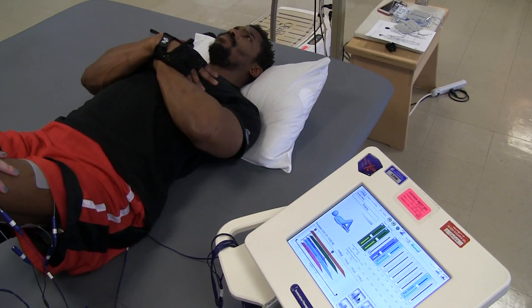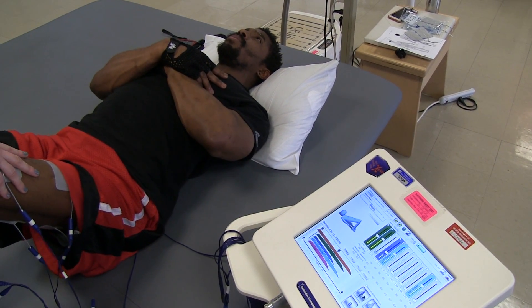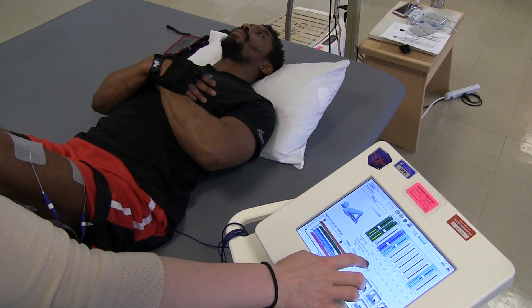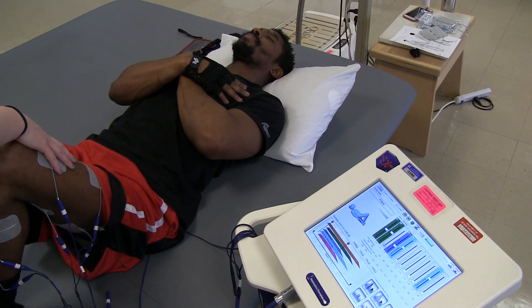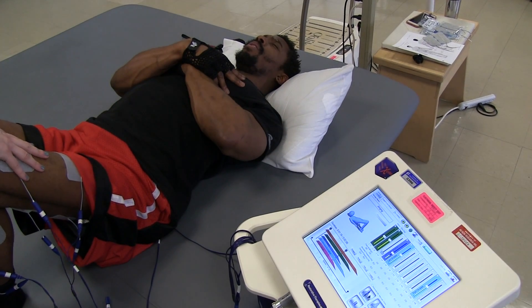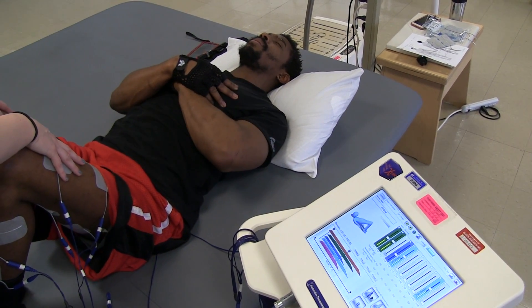Good. Squeeze. Good. Hold it. And down. Good. Up. Good. Three more, okay.